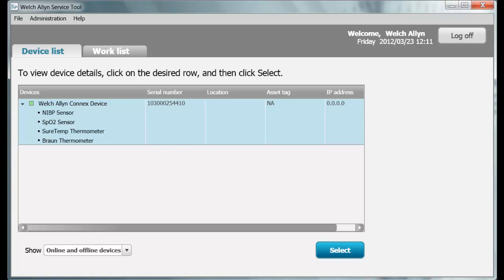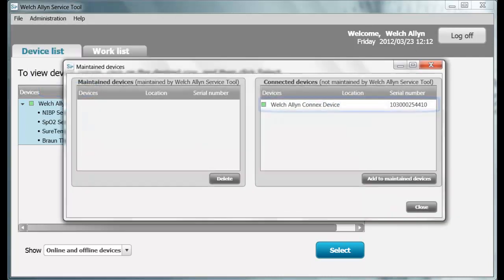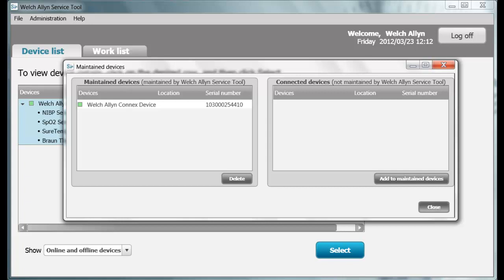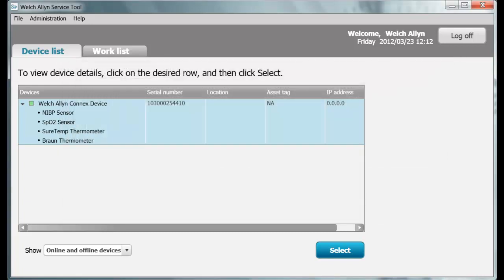The very first thing you should do is add this device to the Maintain Device List. To do this, click on Administration, then Maintain Devices. Highlight your device listed in the Connected Devices section and click Add to Maintain Devices. The device now appears on the left under Maintain Devices. Click Close. Once your device has been disconnected from the Service Tool, the device record is maintained so that Partner Connect can identify and deliver specific updates and information to the Service Tool when they become available.